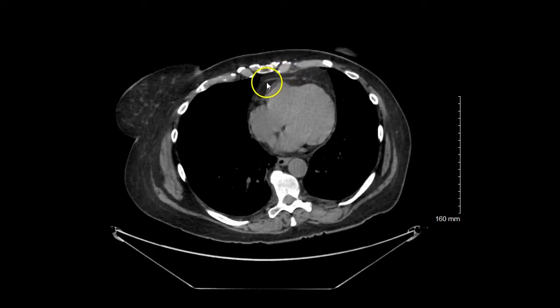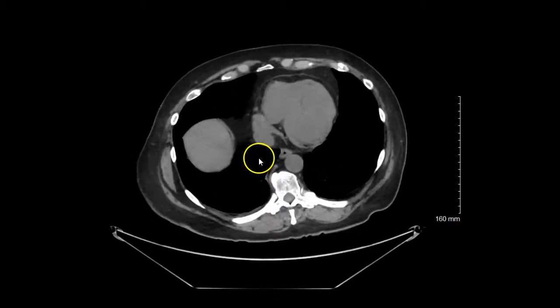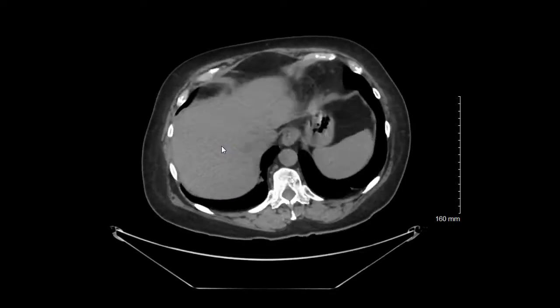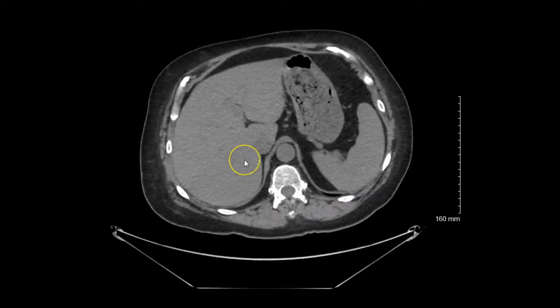When we're looking now at the scan, we're at the superior aspect of the scan. So you can visualize the heart here, and you can visualize some of the lungs. Then we'll go more and more inferior as we dip down. You can see basically the diaphragm slash liver is being visualized. The spleen is being visualized. The posterior aspects of the lungs are being visualized here as well.